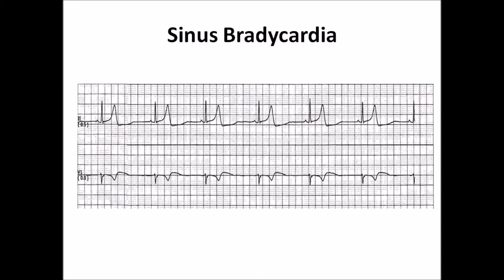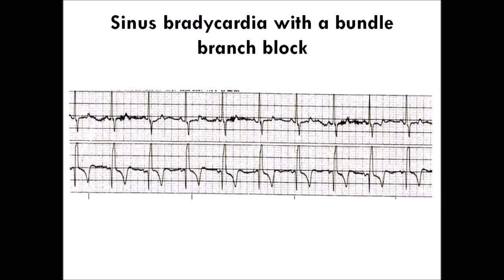This is sinus bradycardia. The P wave is upright in lead 2 followed by a QRS complex with a PR interval of about 0.16 seconds. The atrial and ventricular rates are about 38 beats per minute, computed using the small box method of 1500 divided by 39 small squares. This is sinus bradycardia with bundle branch block — leads 2 and V1 showing an upright P wave in lead 2 followed by a wide QRS with a QR pattern in V1. The PR interval is 0.20 seconds with a 1-to-1 atrial to ventricular ratio at a rate of about 56 beats per minute.